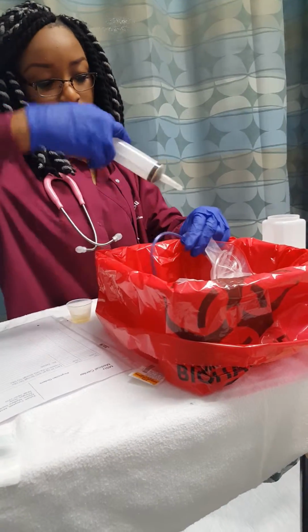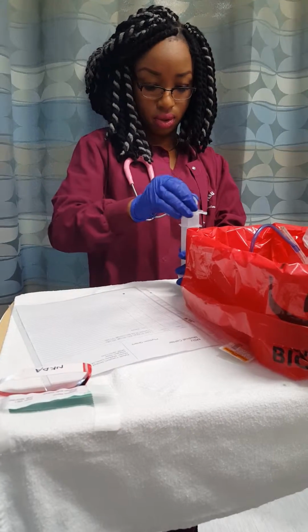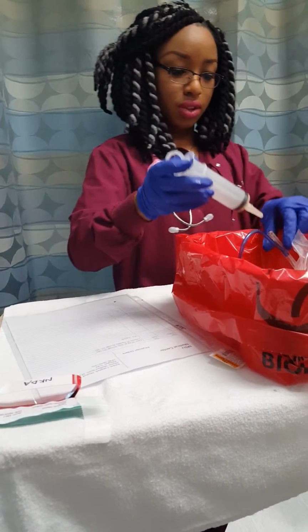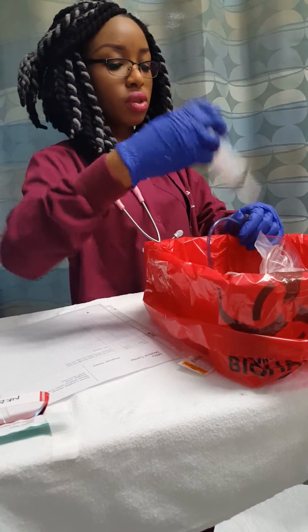Okay. So if you come over and I'm here, going to give my medication. There's a little switch on the back. You need to know this so you look professional for the patient. Okay. Just push it. And I'm also going to insert it into the tube. Comes off. And then when you put it back in, wait for the click.